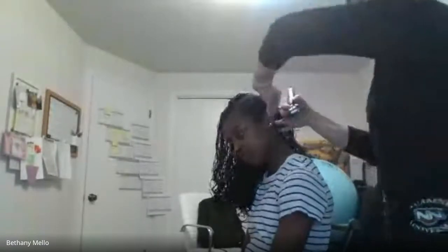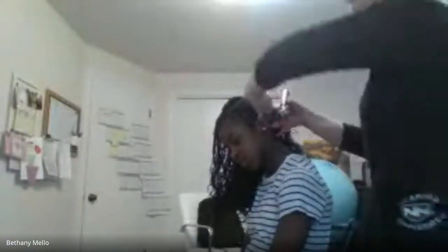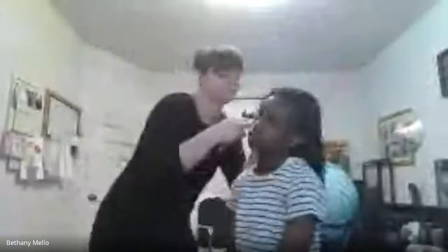The other way here, this is where I actually usually flip and hold it this way, is I'm still supporting her head with these two fingers here, lifting up and back, looking as I'm going into the ear and looking at her tympanic membrane and all around. So this side I usually hold it like that, and this side I usually hold it like this. You just have to figure out what works for you.